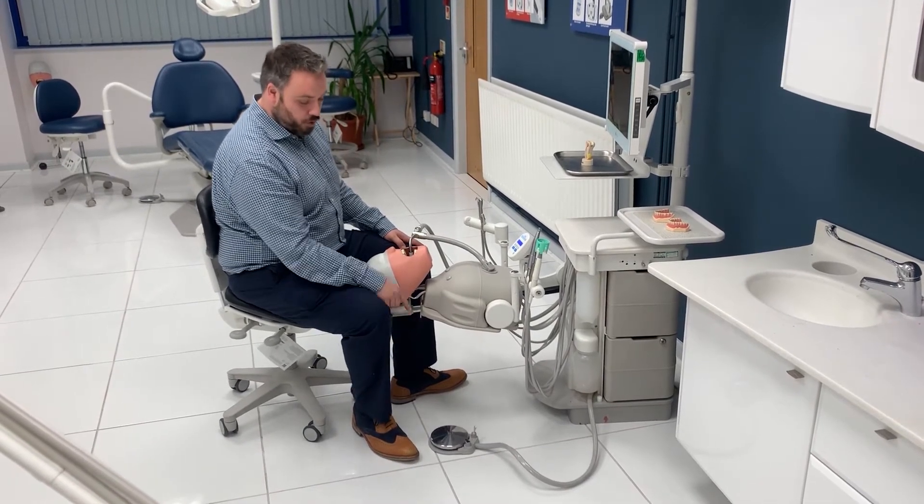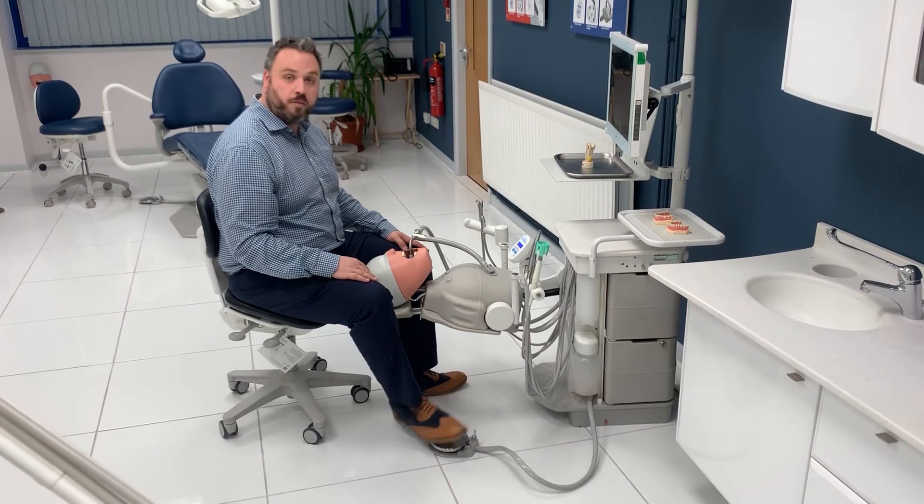You also have a grey toggle with a blue dot, and this will turn water on and off from your handpieces.